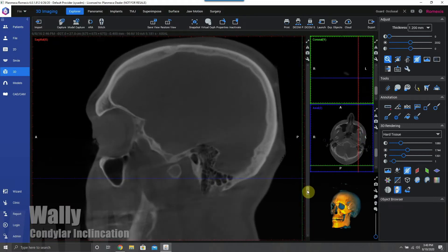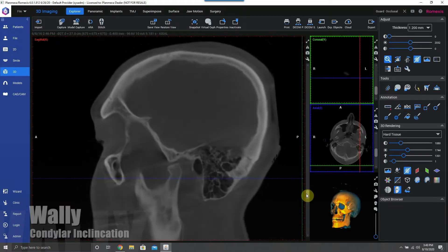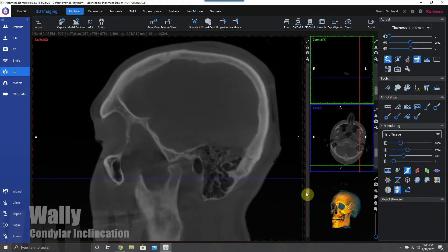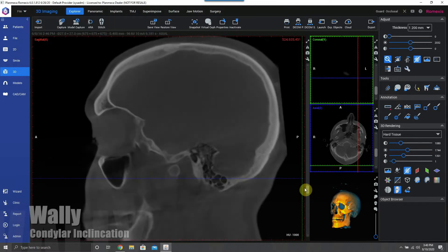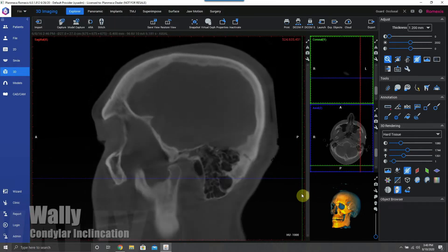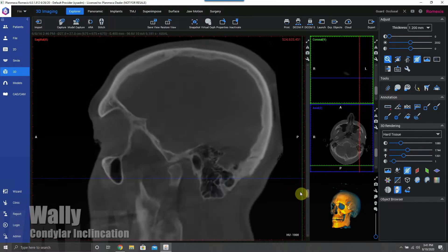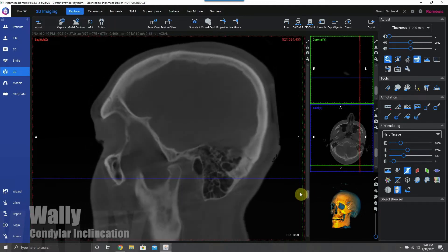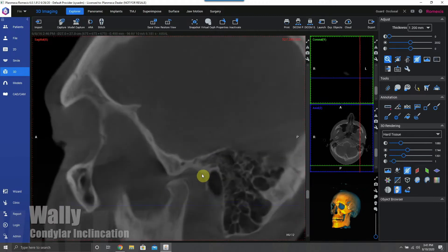The first thing to notice is I do have a full skull scan here on a ProMax ultra-low dose protocol with about 32 microsieverts of effective dose to the patient, which is super low for this quality of a scan for a full skull.